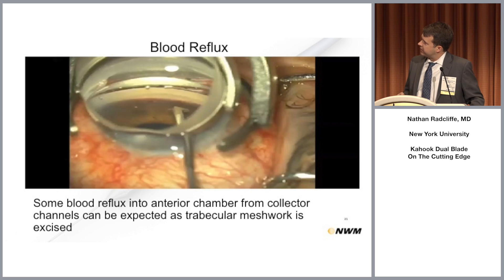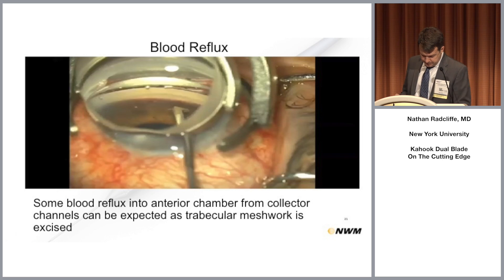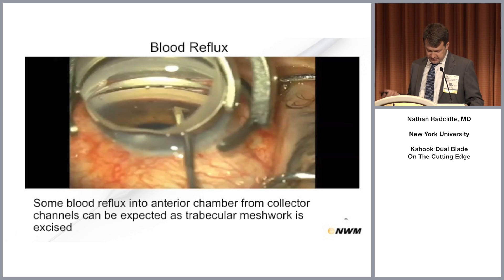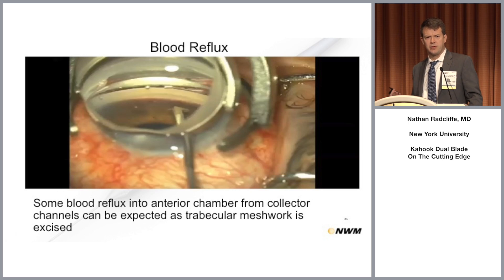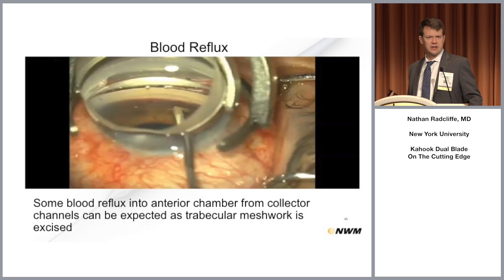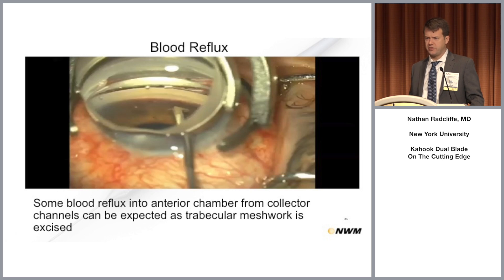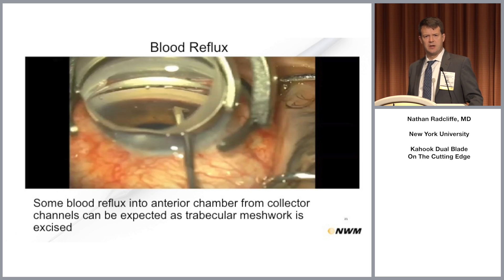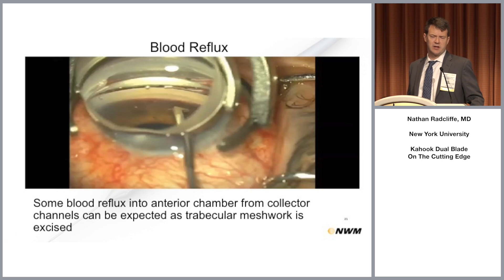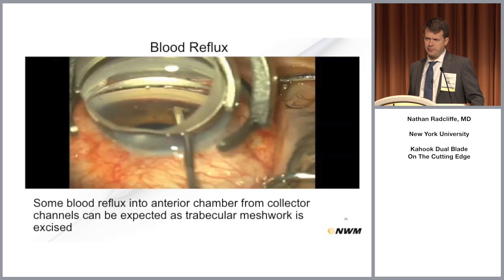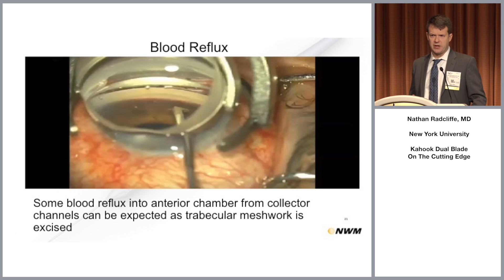We talked about removing it from the chamber. Blood reflux can happen. My pearls: at the end of the case, if you're getting some reflux, just bring the pressure up. Put a lot of BSS in the eye — leaving an eye with a pressure of 30 at the end of cataract surgery to prevent reflux bleeding. That pressure will normalize very quickly and can help get better outcomes.